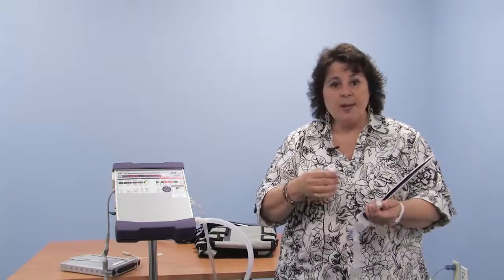So your child may require more frequent suctioning, maybe some saline instillation. They may have thicker secretions while they're using the HME. But they are successfully used by children and adults in the world daily to go to school and be active out in the world and not be tied to the ventilator at home.